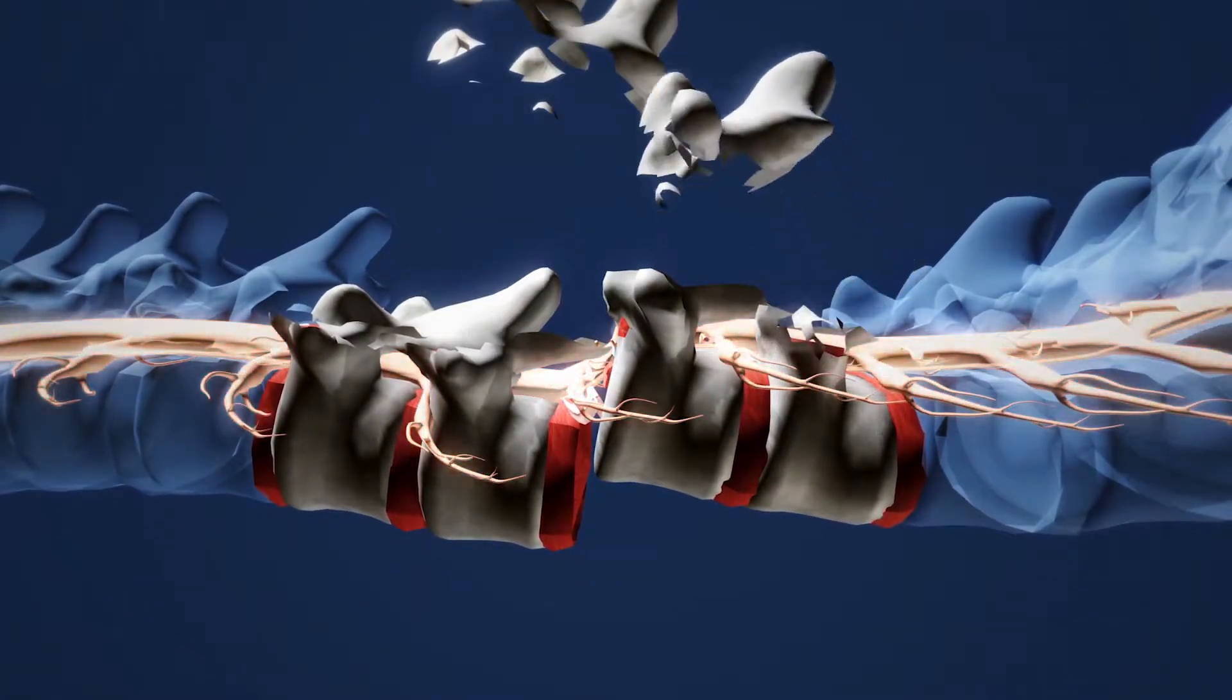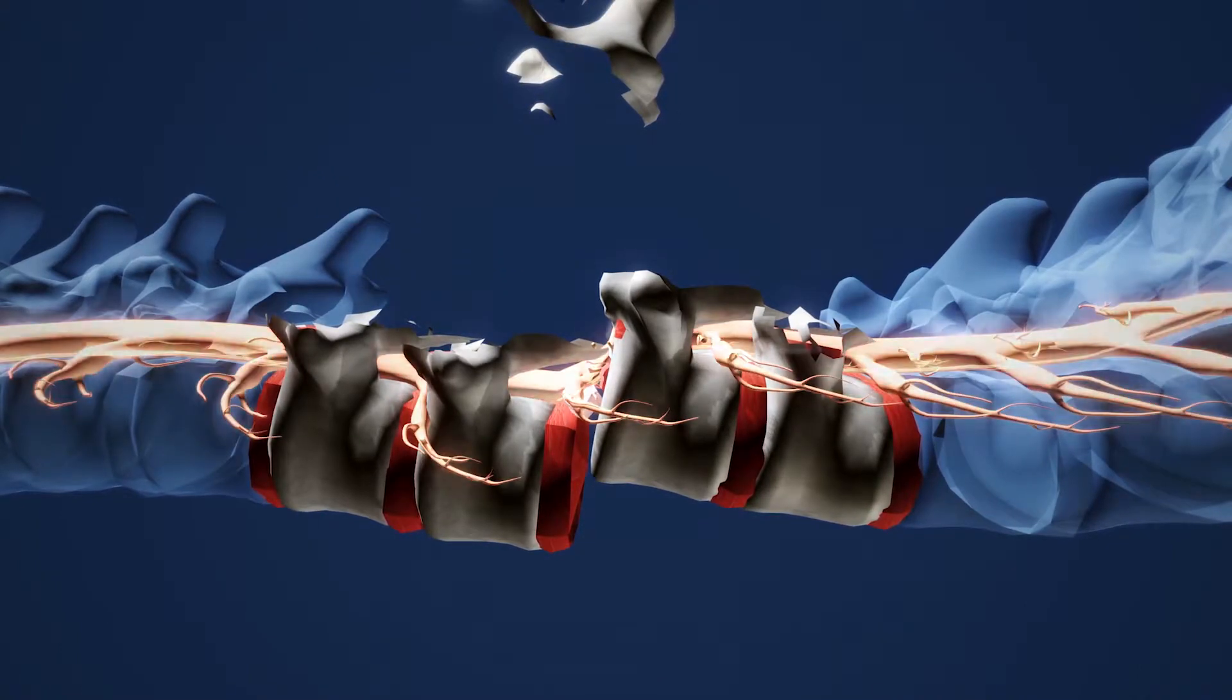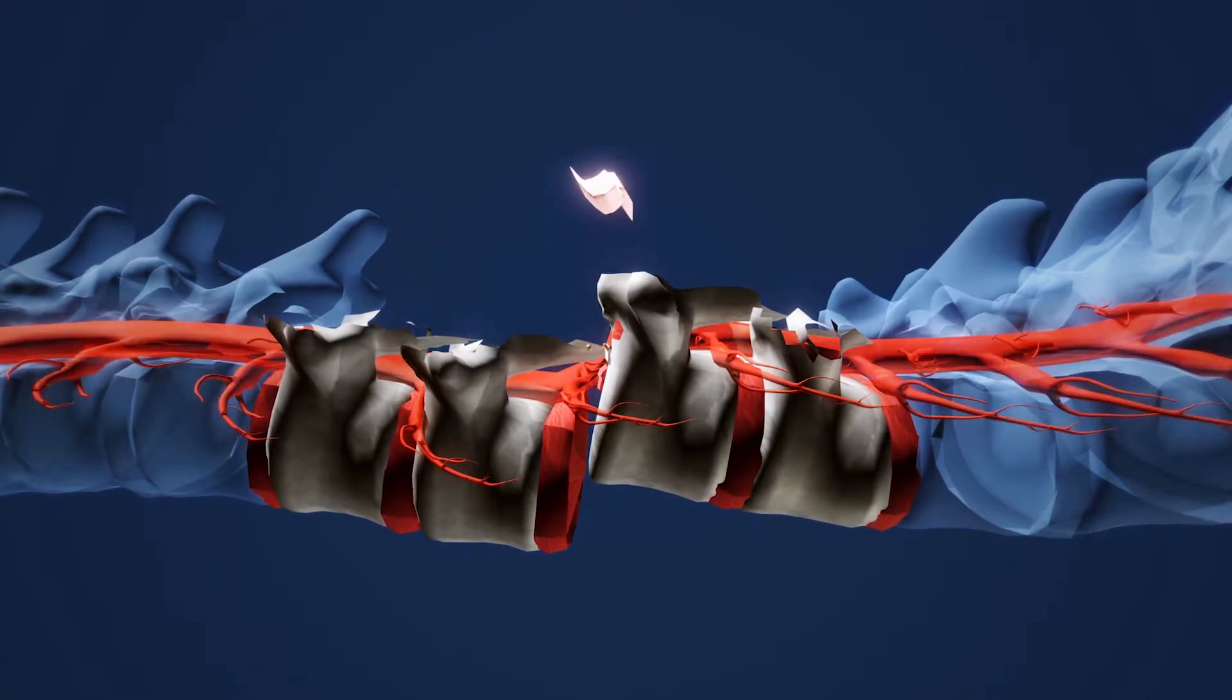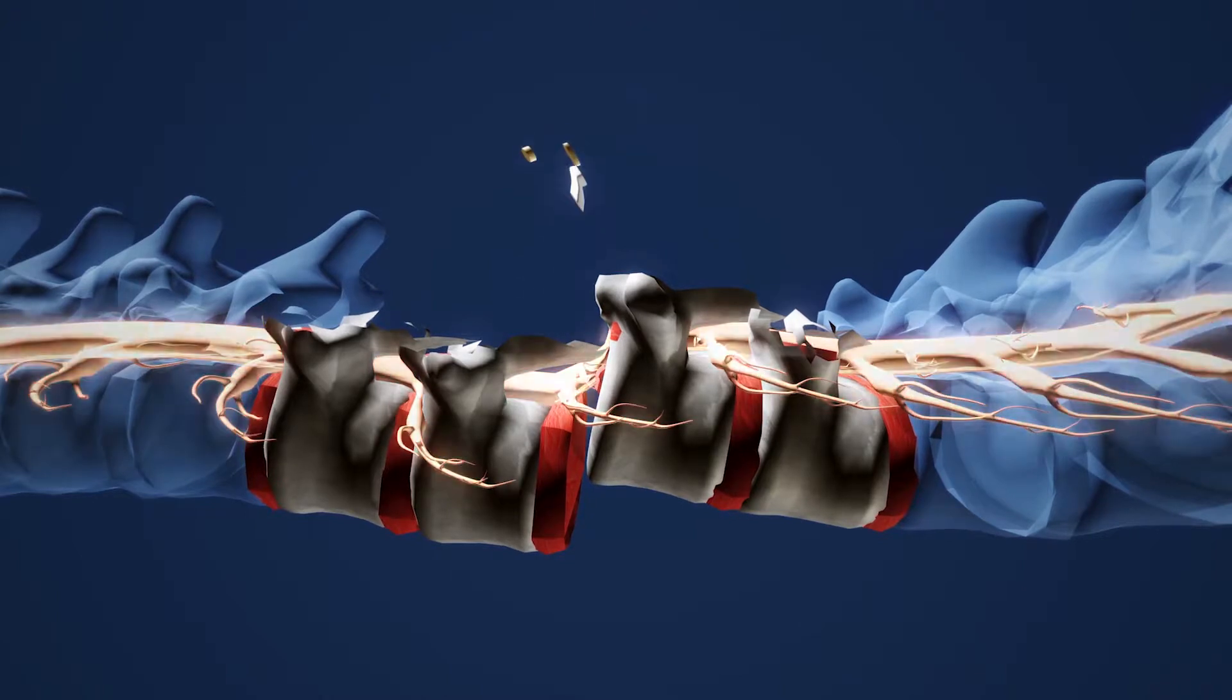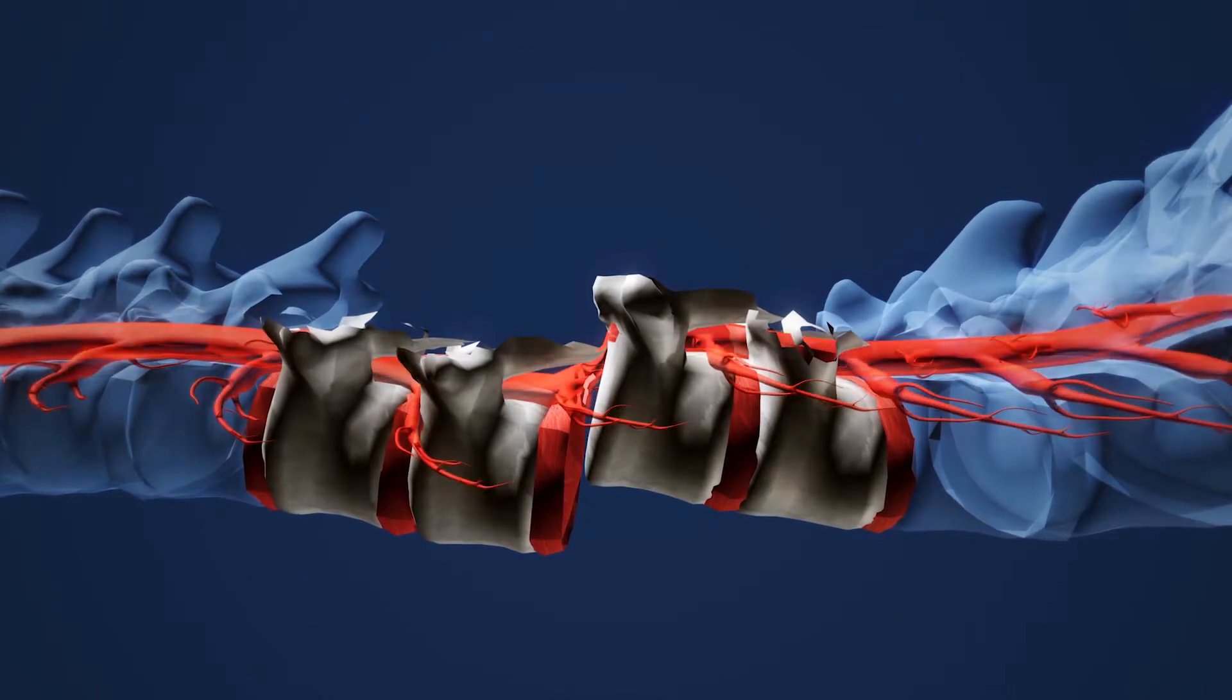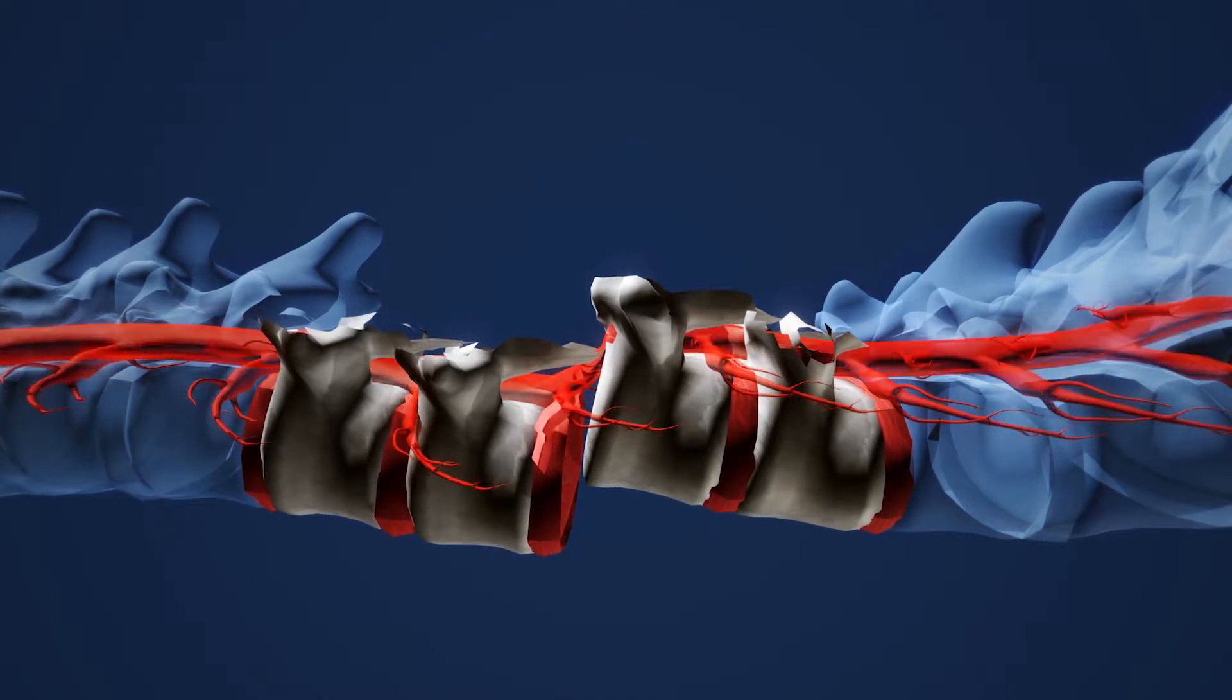So to treat this, we remove all of this bone, the lamina from the back. This allows us to then get into the front of the spinal canal and bring bone, disc, ligament and pull it out of the spinal cord itself.